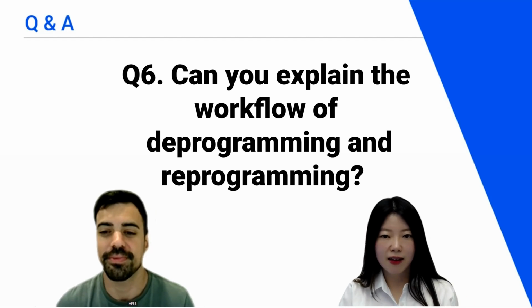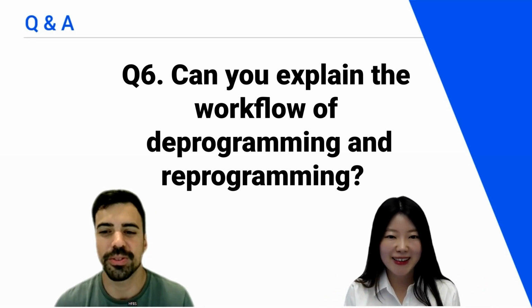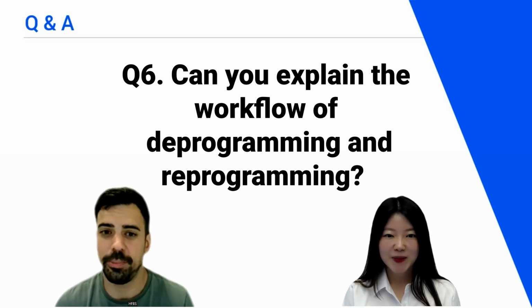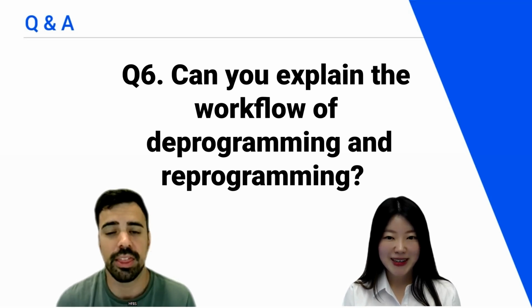So how long does it take when doing deprogramming and reprogramming? Which one is faster, or how long, in real terms, does it take? So deprogramming differs from patient to patient. If the patient is really easy to deprogram, in 5 minutes the patient can be deprogrammed.